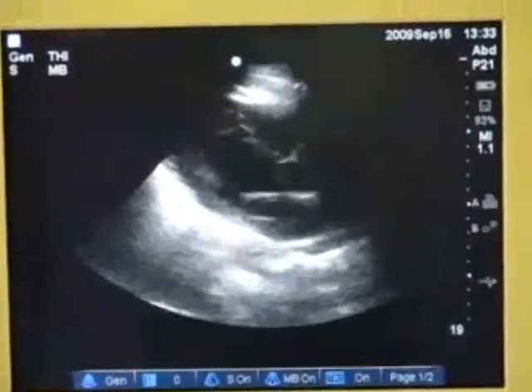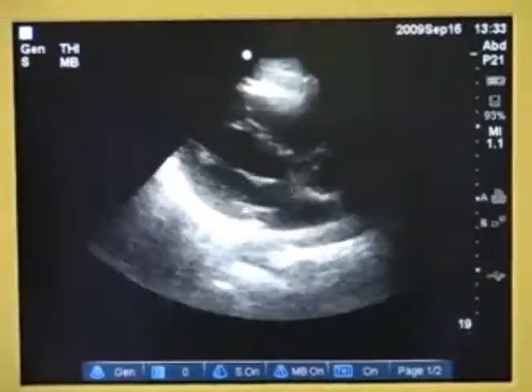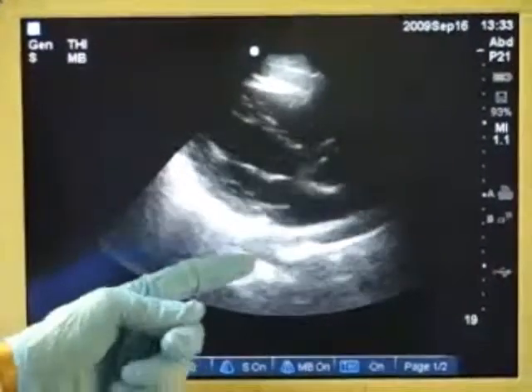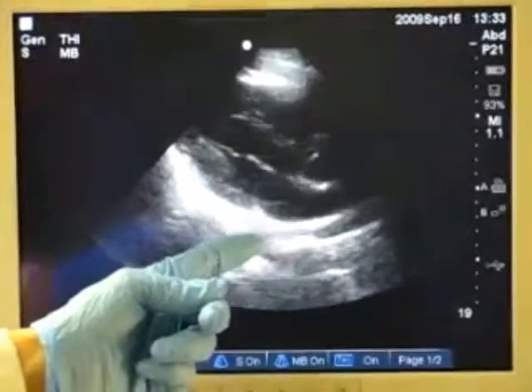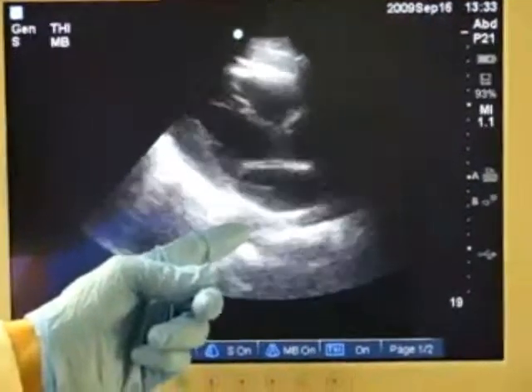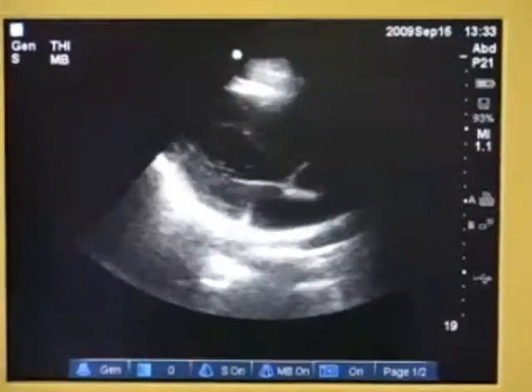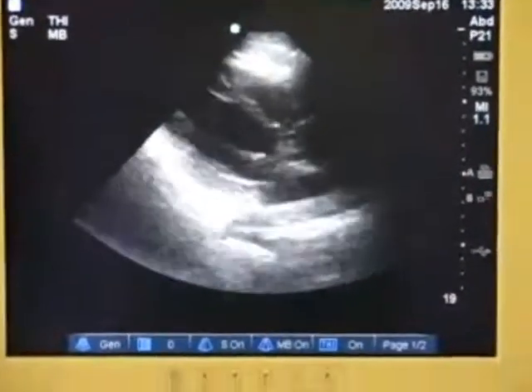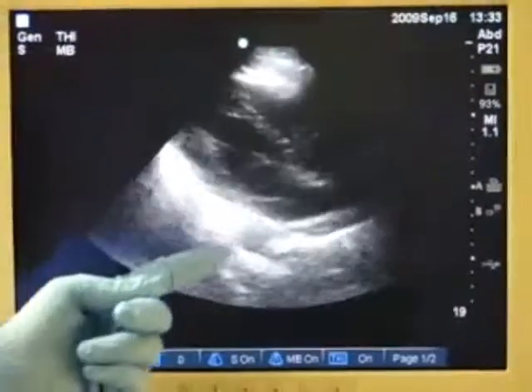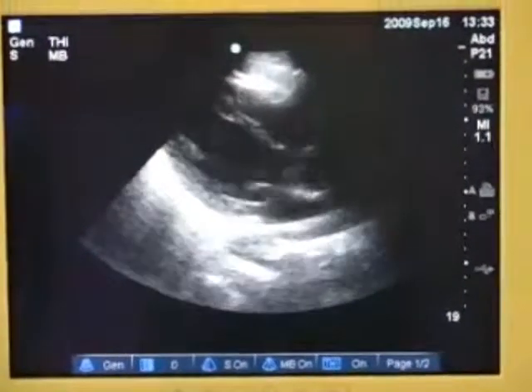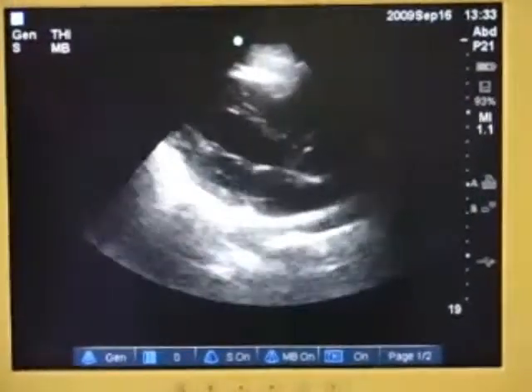Other structures that are commonly seen in this view include the descending aorta, which in this orientation is a circular structure.